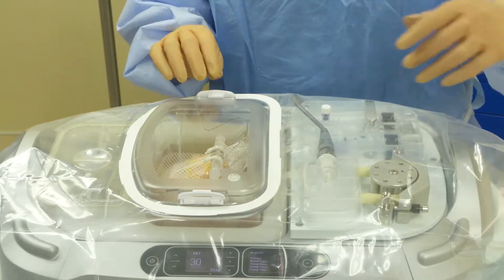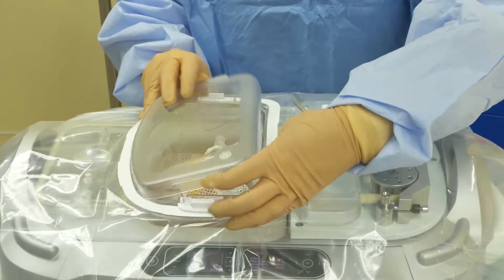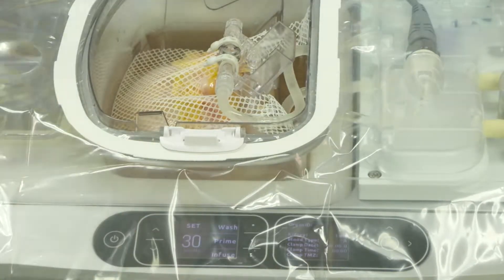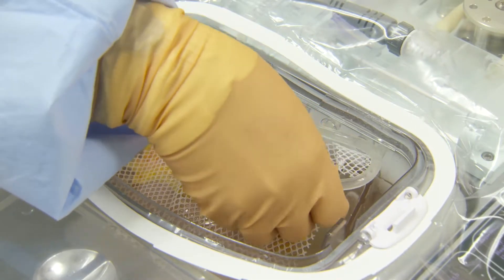Remove the inner lid from the perfusion circuit and press stop to stop the infusion. Detach the infuse line from the cannula.